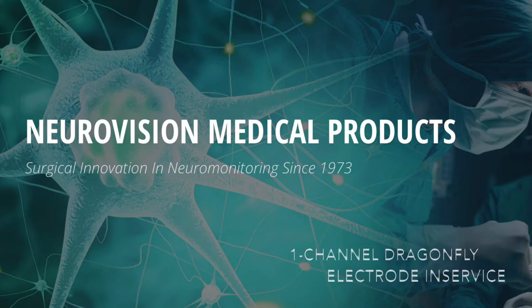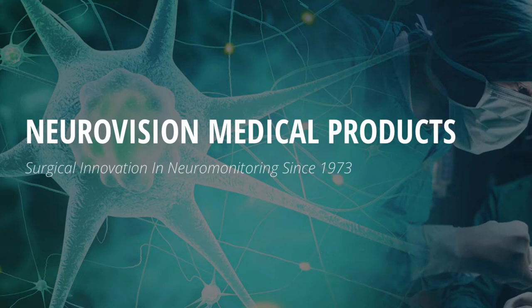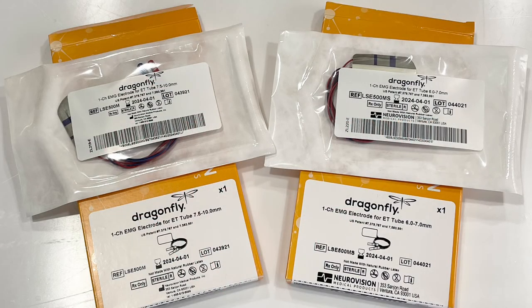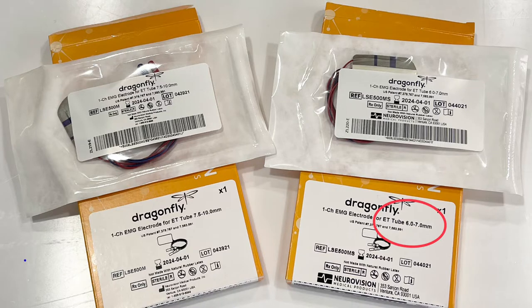The one-channel Dragonfly electrode provides safe, reliable, and universal laryngeal EMG monitoring. It is designed to be applied to any standard ET tube. NerveVision Medical offers two kits with Dragonfly electrodes that fit either a 6.0 to 7.0 ET tube or a 7.5 to 10.0 ET tube.